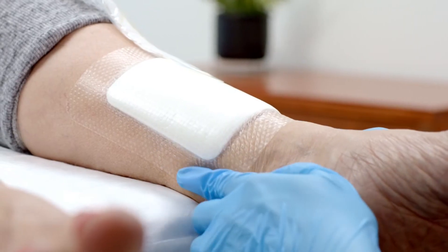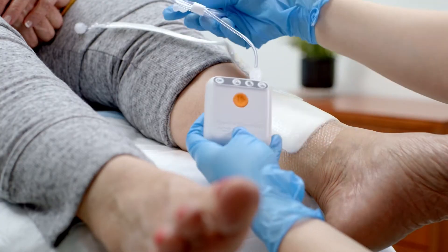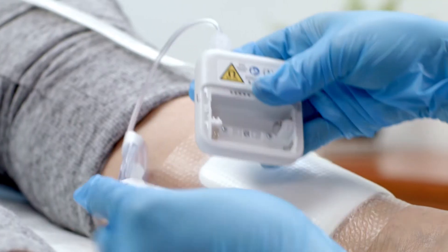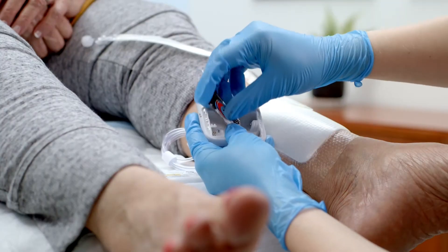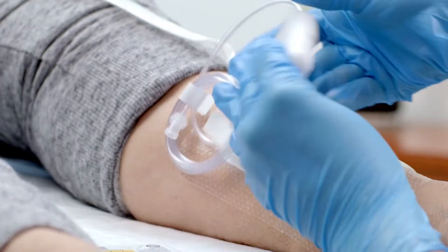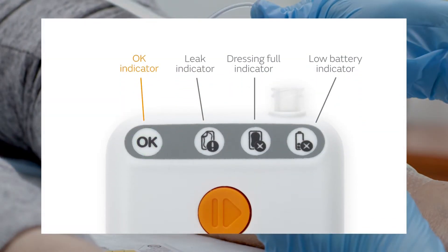Your health care provider will apply the dressing, which attaches to the pump with plastic tubing. On the pump, you'll see a compartment for batteries and a power button. This is how your health care provider will start your therapy. You'll know that your PICO system pump is working correctly when the green light located at the top of the device is flashing. Note also that the pump features a series of lights that will alert you to the status of your device.